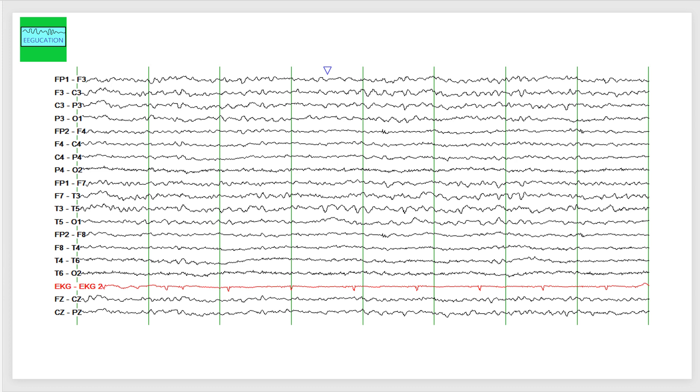Because of the lower amplitudes on the right hemisphere, this may signify a structural abnormality on the right hemisphere, a destructive structural abnormality on the right hemisphere. In this case, that was related to the stroke that this patient experienced in the past.